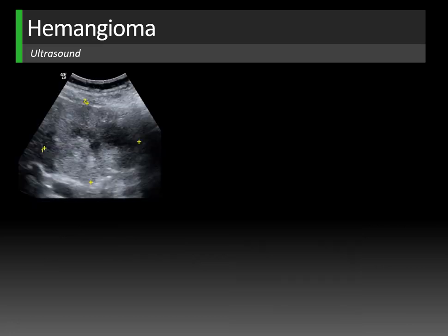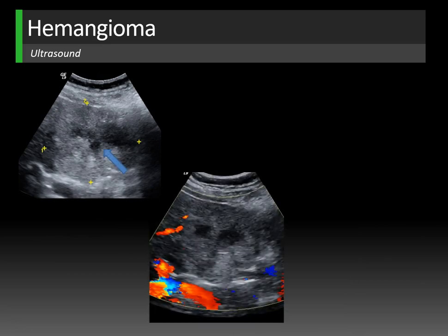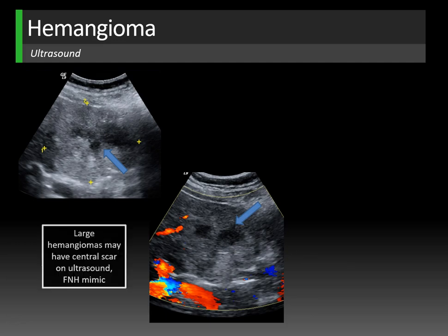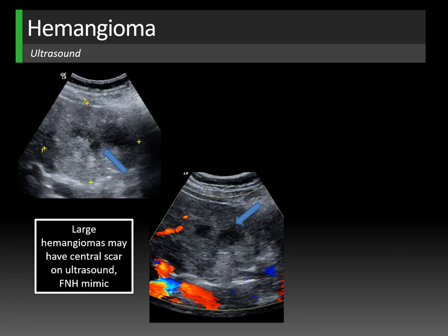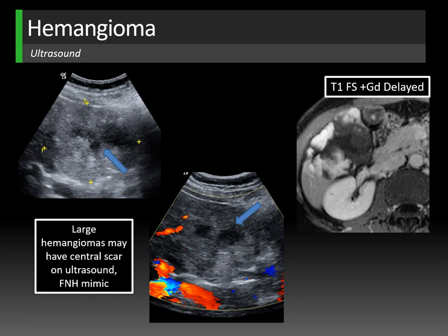Here's a patient with a large heterogeneous mass in the right lobe — echogenic with central hypoechogenicity and no real color Doppler flow, with a central scar or hypoechoic region visible. In a young female, you might think of focal nodular hyperplasia, but this was actually a hemangioma. Large hemangiomas can have central scars on ultrasound and mimic focal nodular hyperplasia or other masses. The correlative MRI shows the typical hemangioma enhancement pattern.